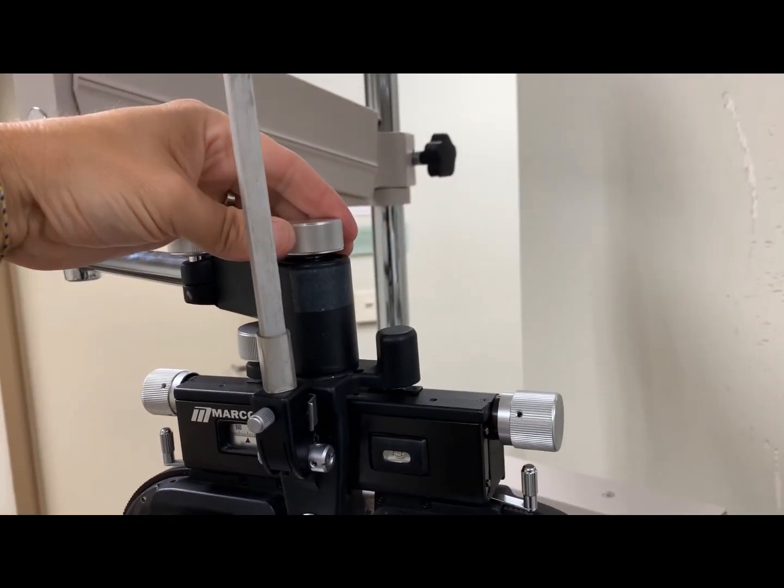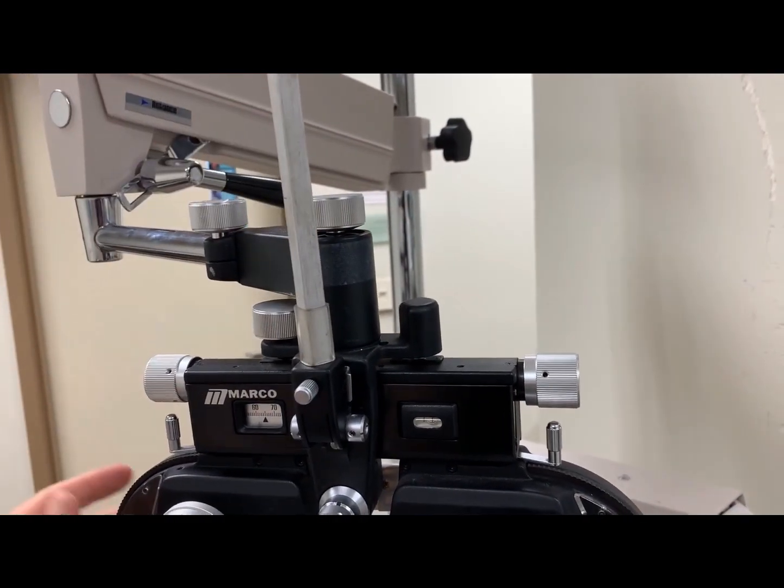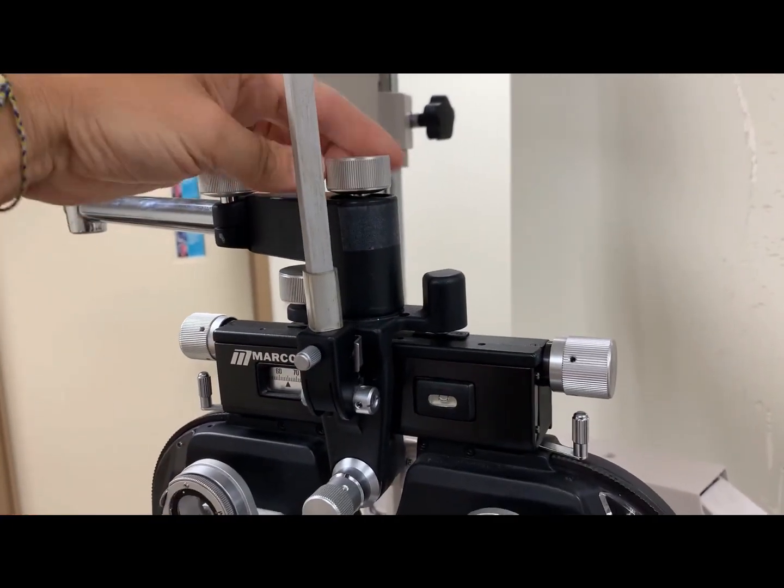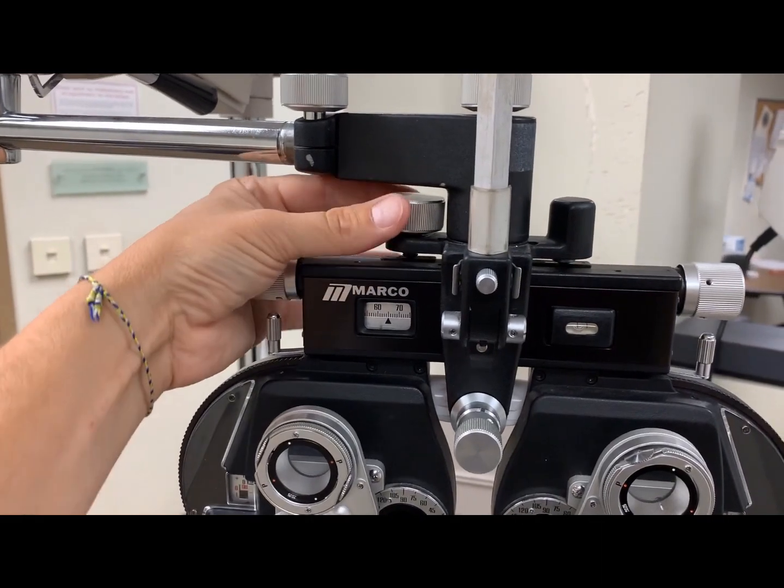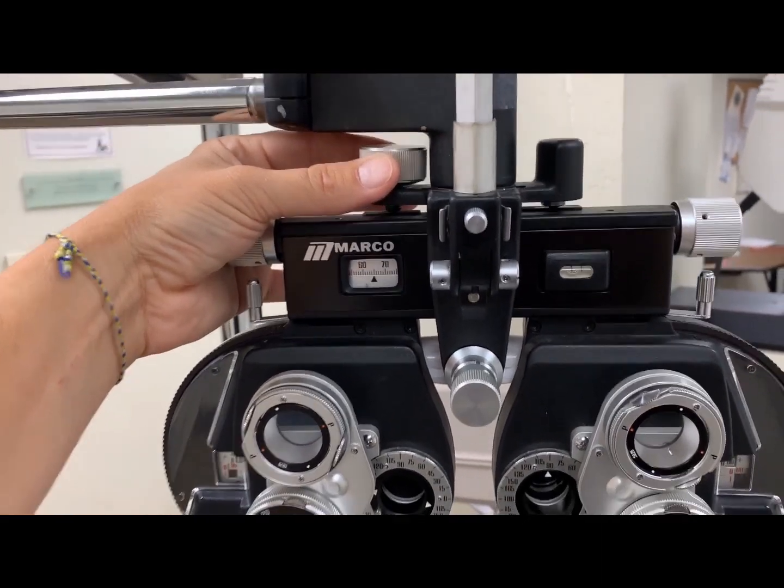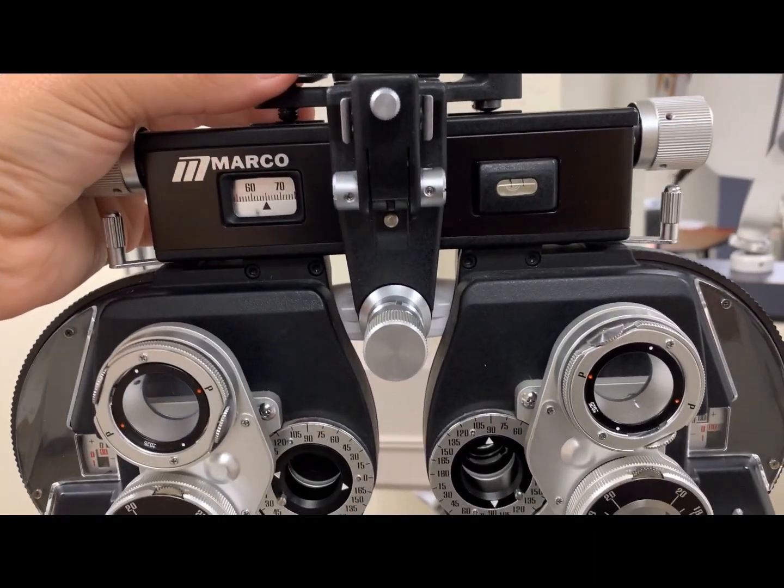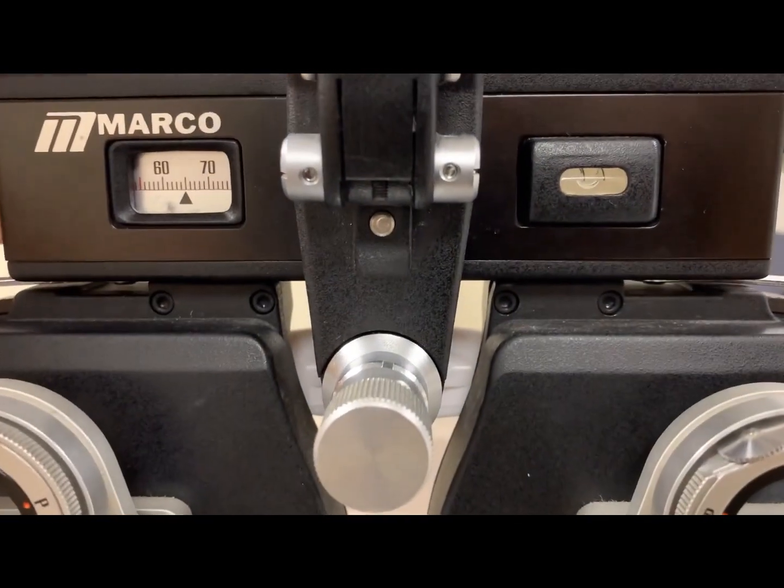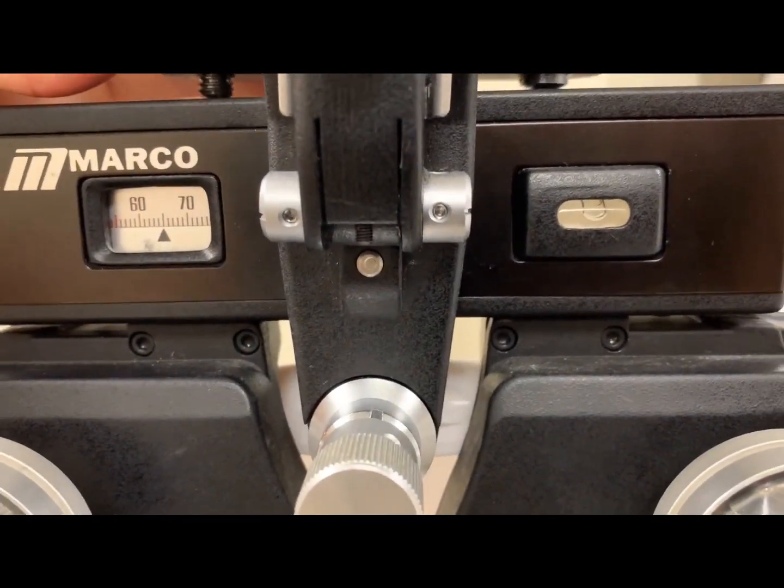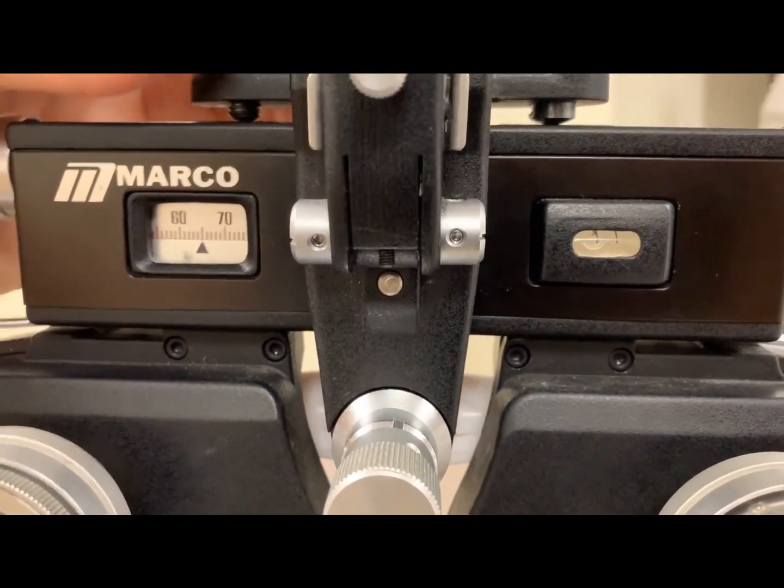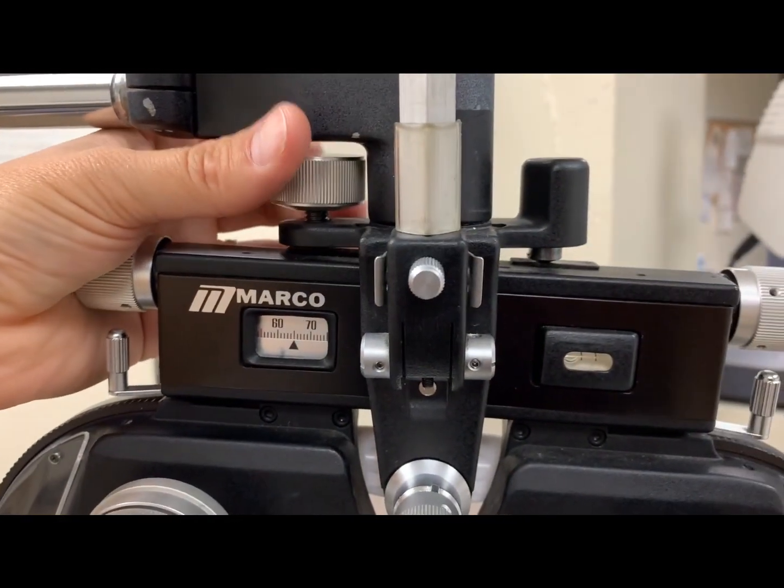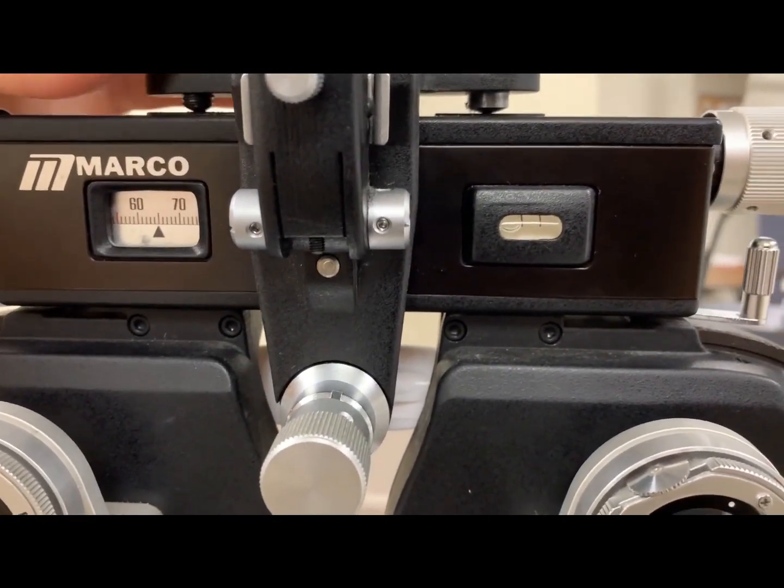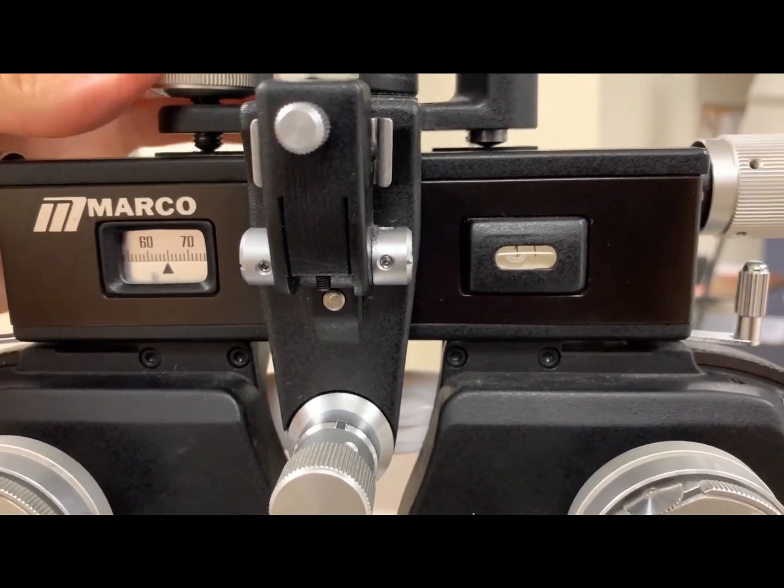On the top, the lock knob allows you to loosen and rotate the phoropter about the C-axis. This knob will simply change the leveling of the phoropter, and you'll notice that there's a leveling bubble that changes as I loosen the knob. You want the phoropter to be level throughout your testing with your patient.